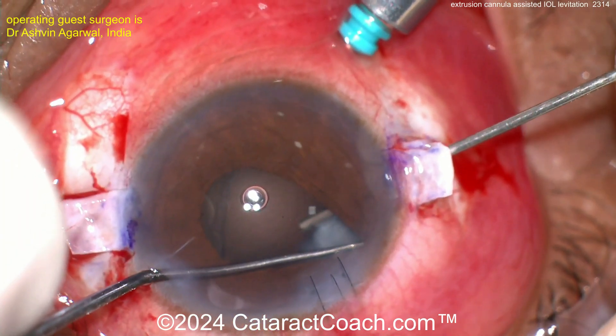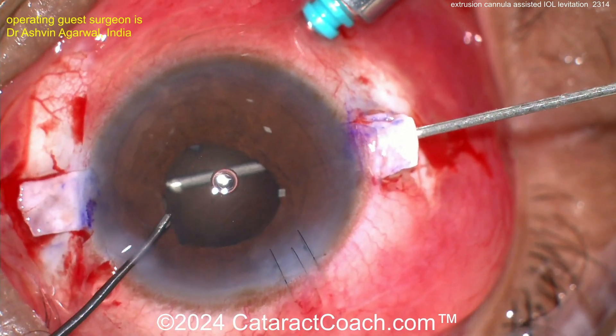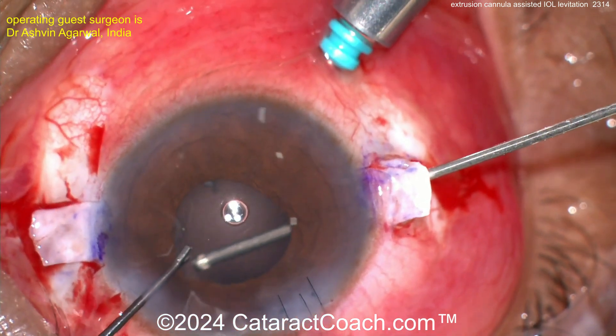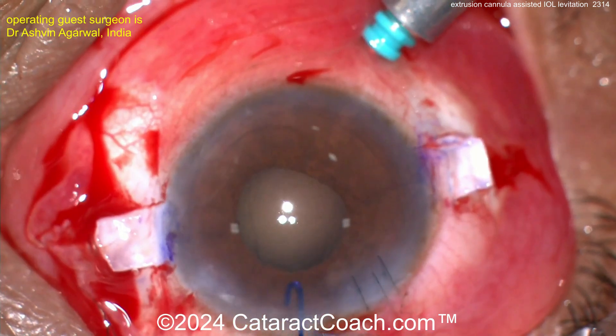Cleaning up and getting the vitrector in there. You have to get that lens material out — this patient deserves a full pars plana vitrectomy, especially if that IOL is sitting on the macula, which you're going to see. You saw the slit lamp slide, so you know where the IOL is.